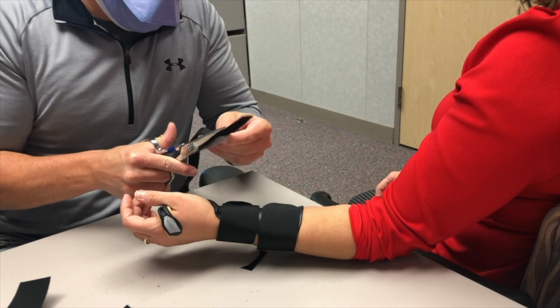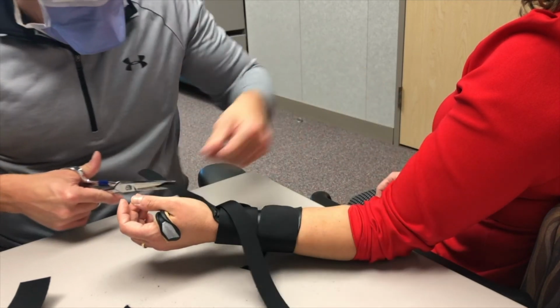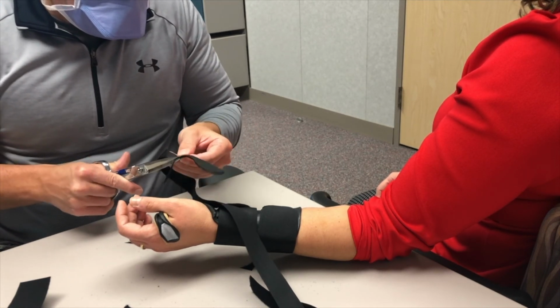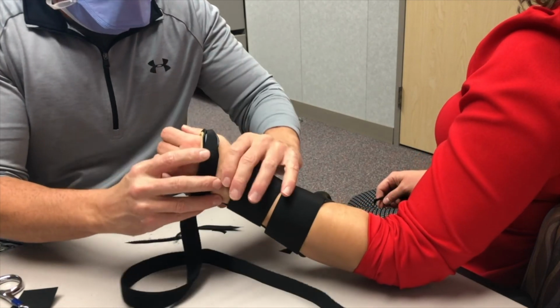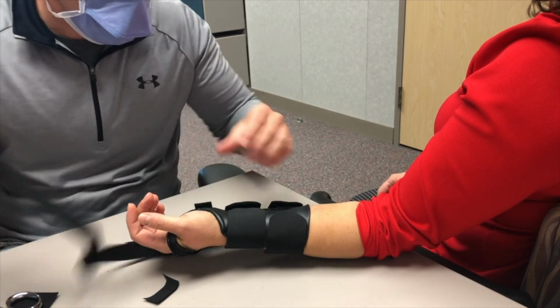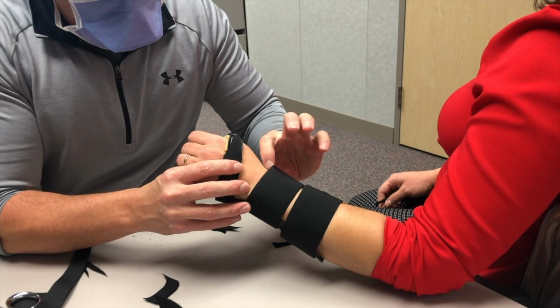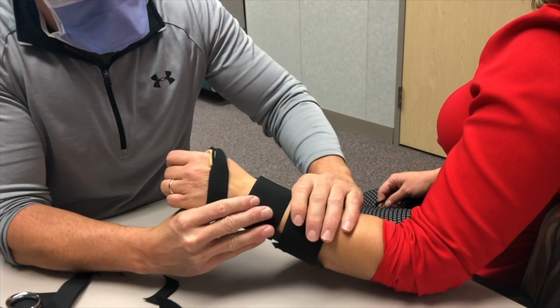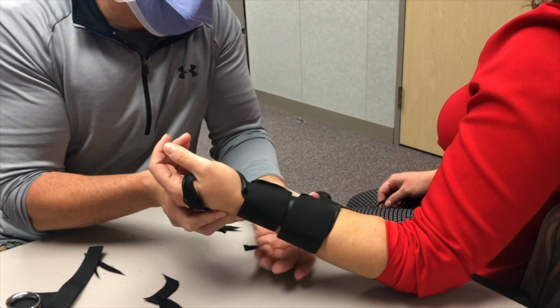Now, we're just going to cut this 1-inch strap a little narrow so it can fit through the web space. Now we can adhere the Velcro, come across. Then now we want to check fit. We want to pronate and supinate. Make sure that it's not pinching over the radial styloid or the ulnar head. We want to make sure our straps are applied, in particular over the dorsum of the wrist, and otherwise I think this splint looks satisfactory.